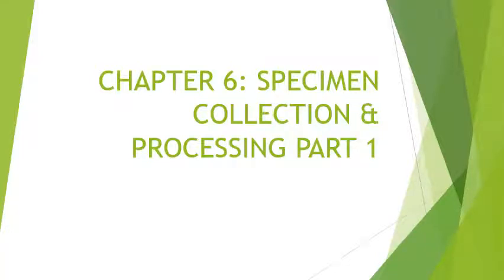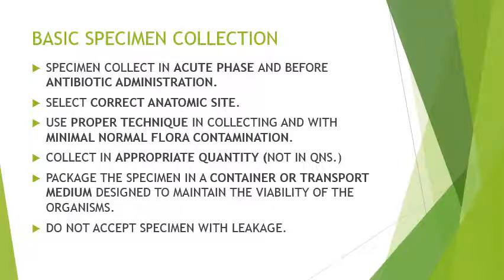Hi, I'll be discussing Chapter 6 for the laboratory, Specimen Collection and Processing Part 1. In the microbiology laboratory, we do specimen collection, particularly collection of blood, stool, urine samples, body fluids, and swabs.